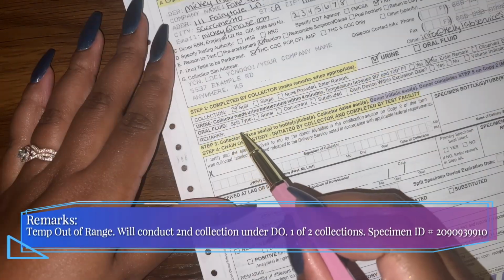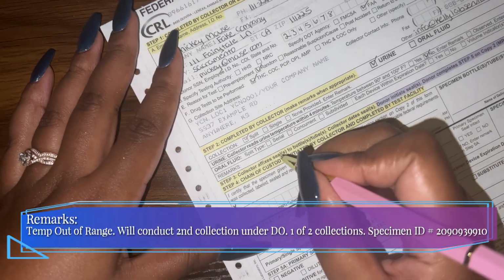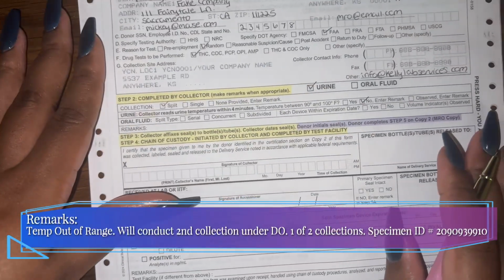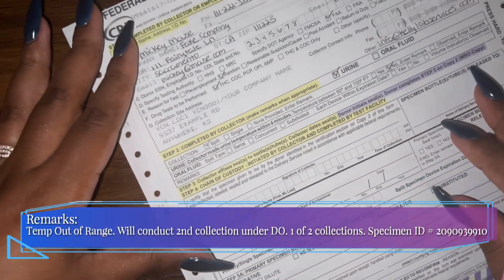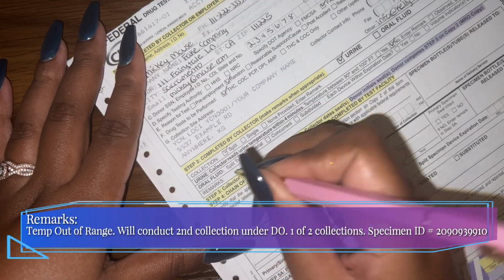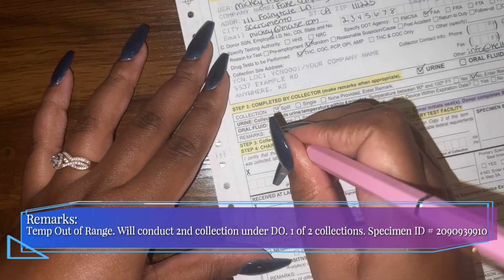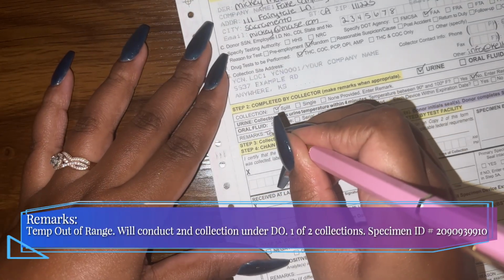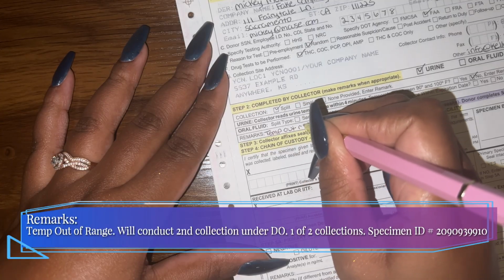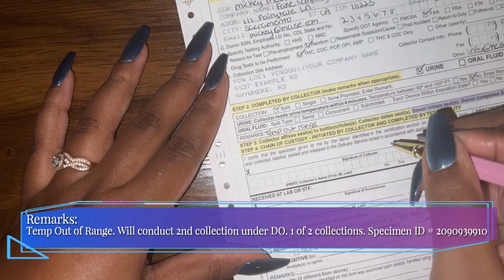Okay. Here's your remark that you need to write in when there is a temperature out of range. Now, you want to practice writing small because you don't have that much room, as you can see on this line, to write a lengthy note. So you want to try to write small, but make sure that it's still legible. Okay? So your remark is going to read, temp out of range, because we are going to let them know right away what's going on. The temperature is out of range.